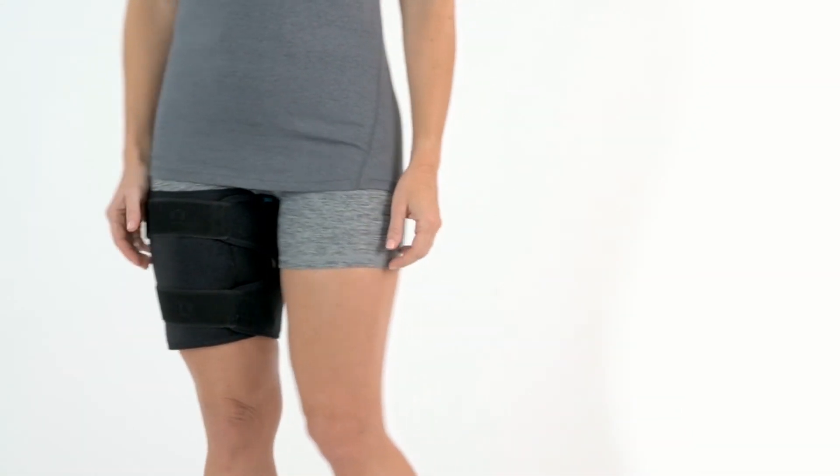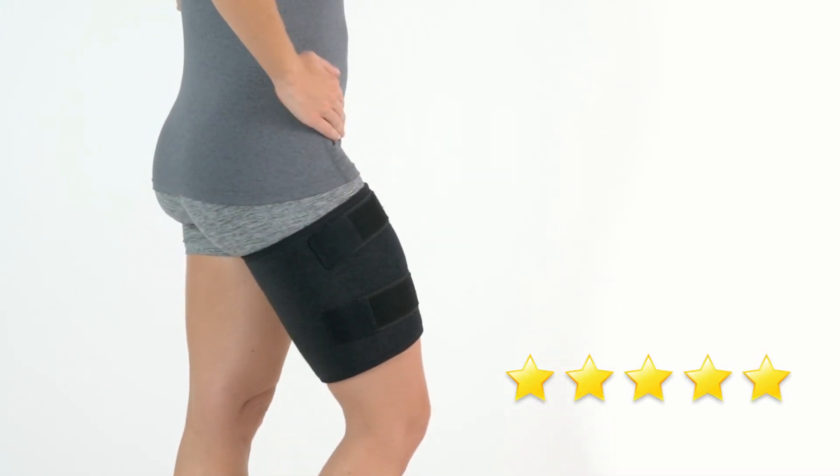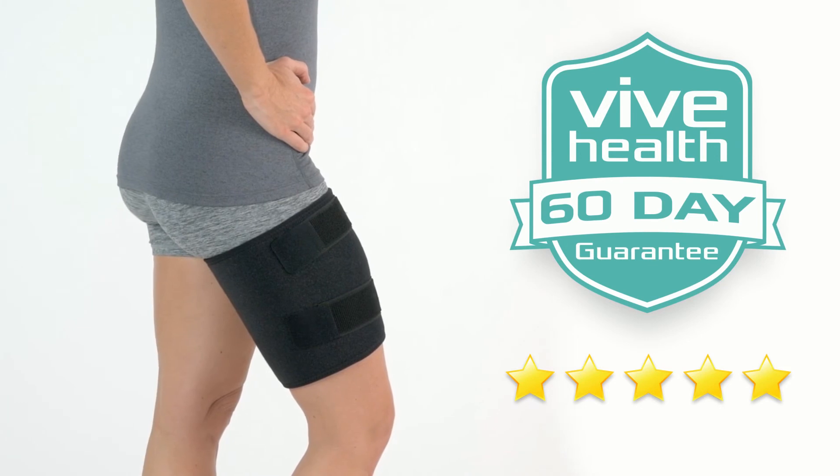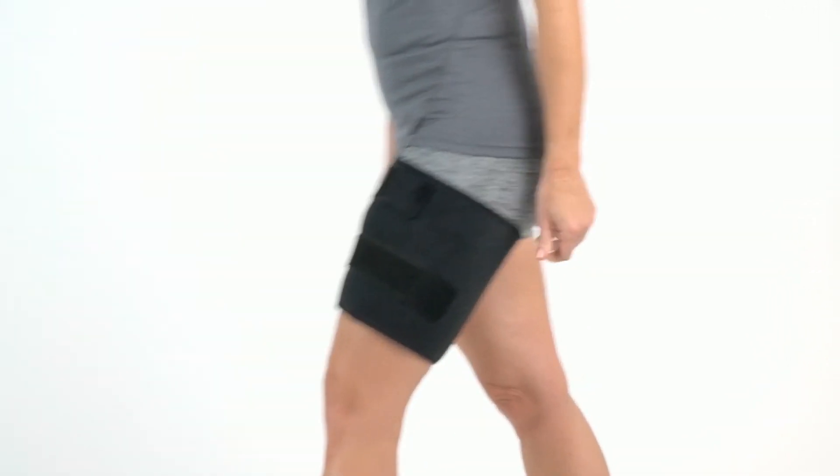The Thigh Brace by VIVE is trusted and proven. Check out the 5-star reviews! Plus, it's backed by an unconditional 60-day guarantee. You can't beat that anywhere! So confidently order your brace now for the versatile support you need.